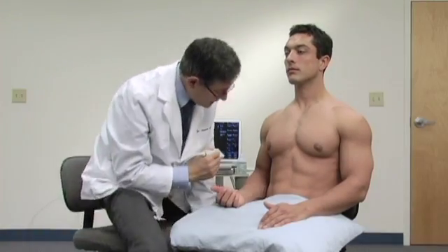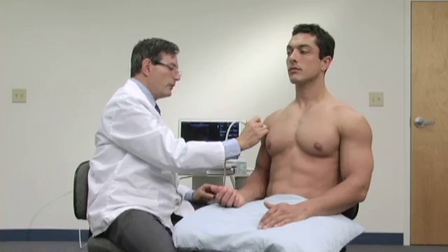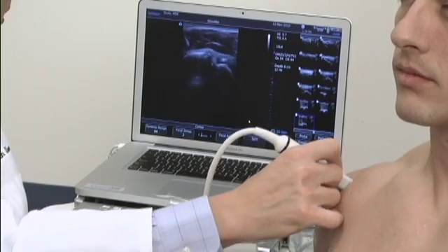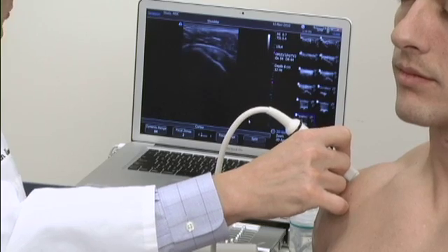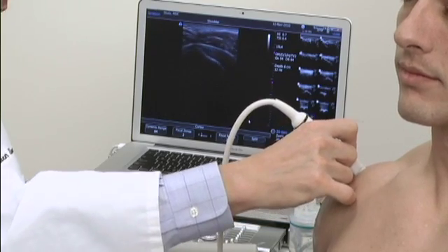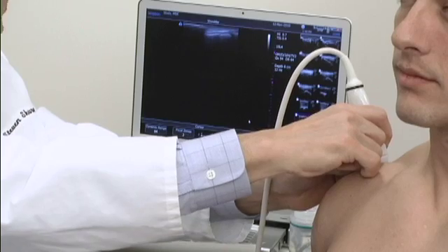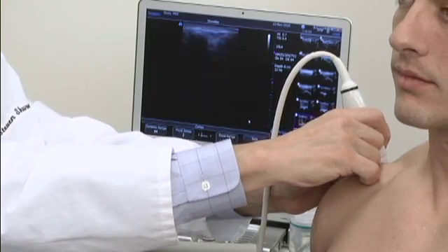We're going to next look at the acromioclavicular joint. To look at the acromioclavicular joint, we have one of two approaches that work well. We can follow the biceps tendon up to where it just starts to disappear underneath the acromion. If you rotate the probe up over that, you'll usually be right at the acromioclavicular joint.